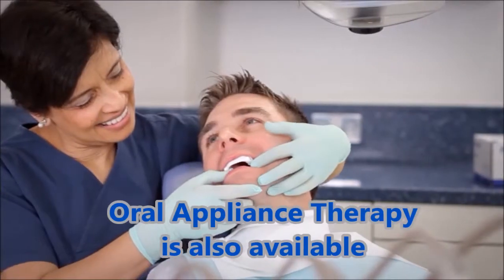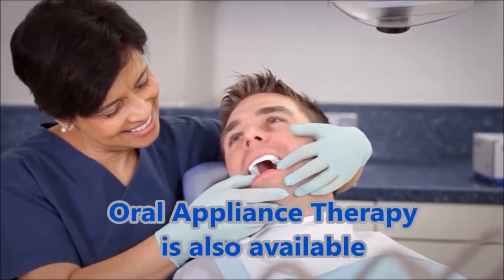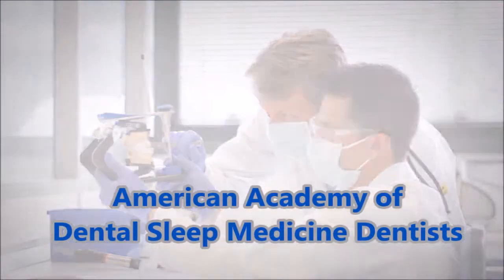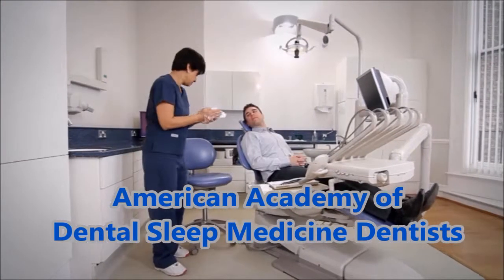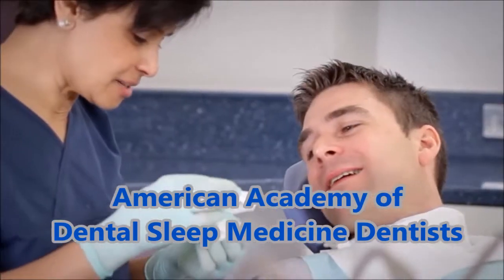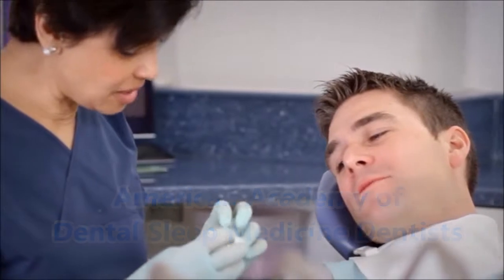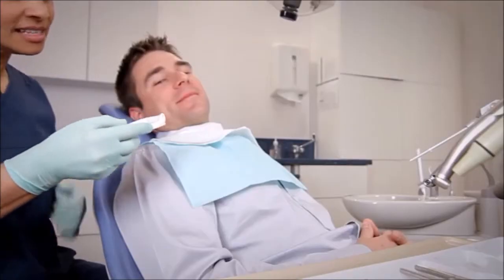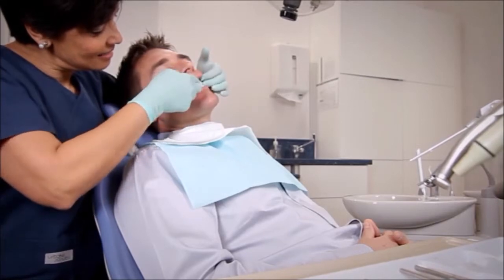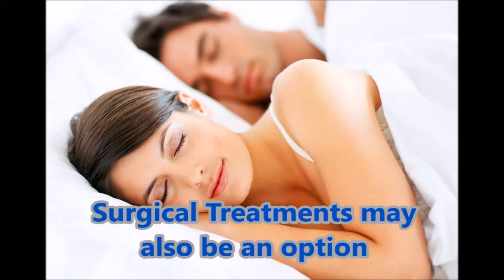If you test negative or have mild to moderate sleep apnea, we can refer you to have an oral appliance created by one of our American Academy of Dental Sleep Medicine dentists. They will review the different manufacturer brands, take an impression for a custom device, provide a home test to verify effectiveness, and make adjustments when necessary. Surgical treatments may also be an option for some patients.